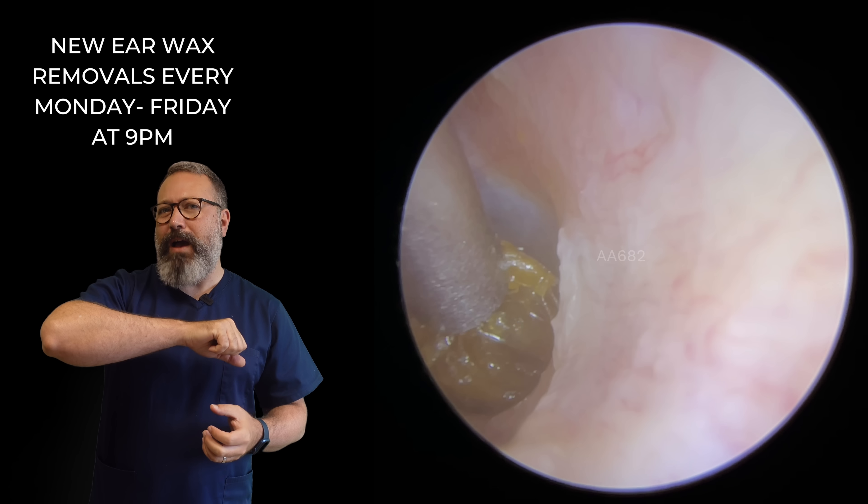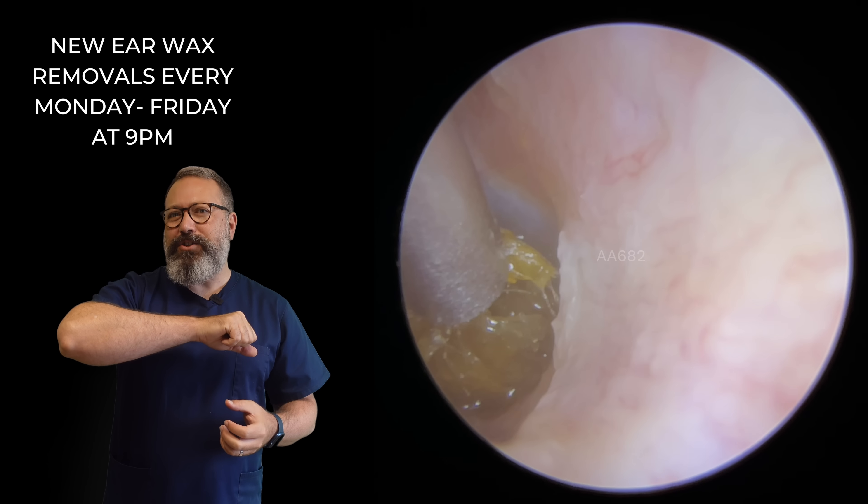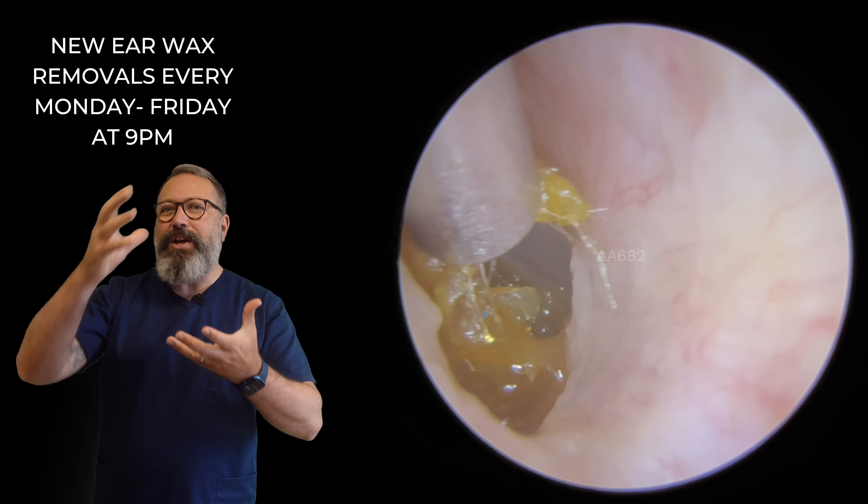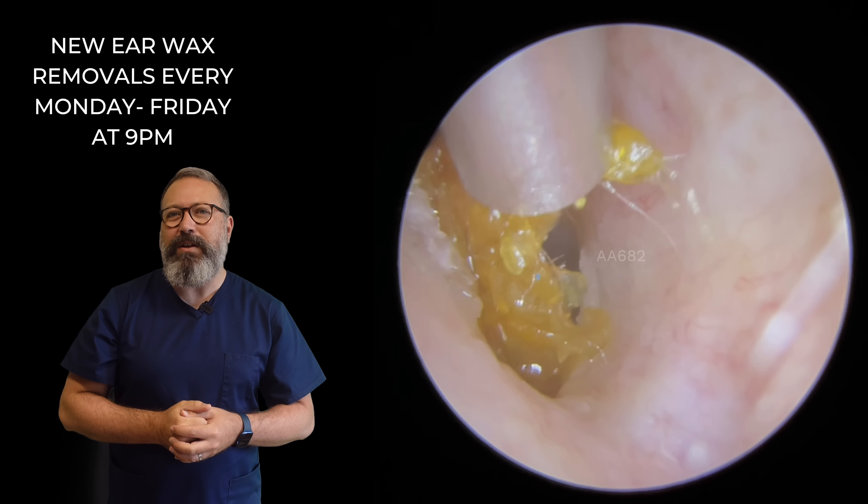Now we've got a good grip there. Watch what happens to that plug — the outer section there just starts to peel away as we're bringing this out, almost like a little shell around the outside edge. So this is coming away really nicely.